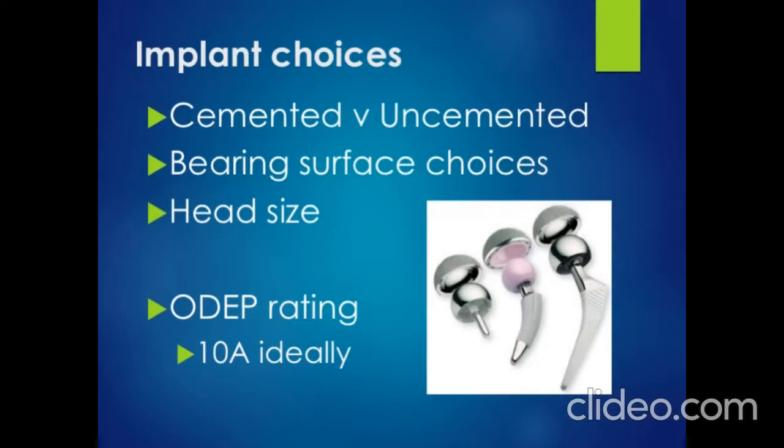To talk about the ODEP rating, that's an assessment of the likelihood of requirement of revision for that implant. And we all should really be using something that has a 10A ODEP rating, which means that it's been followed up for 10 years and has a certain success rate and a low requirement for revision surgery.